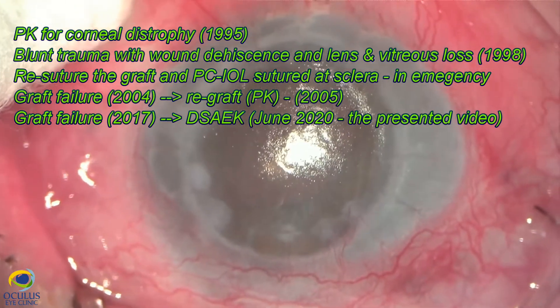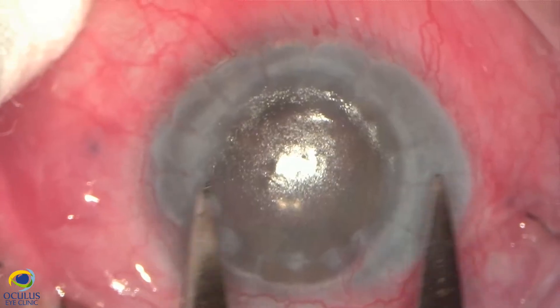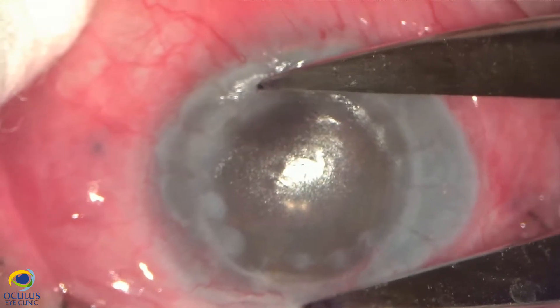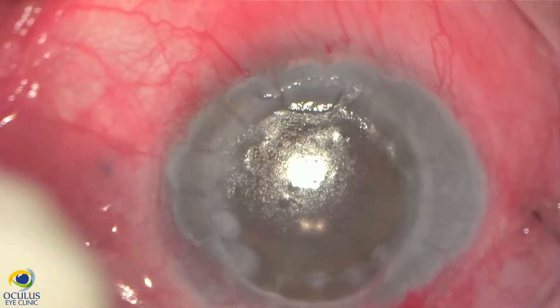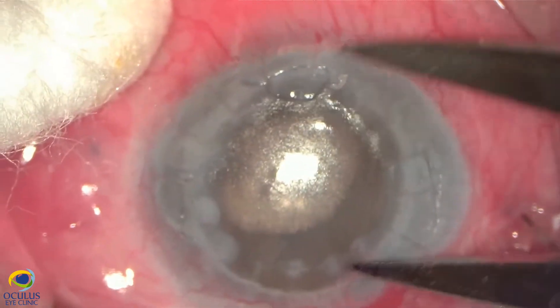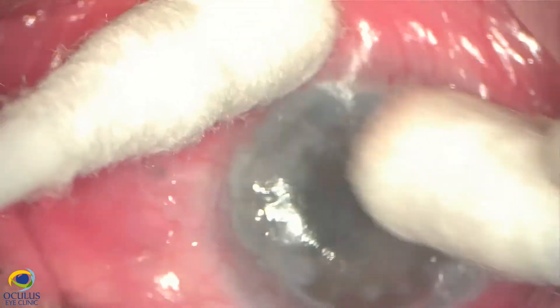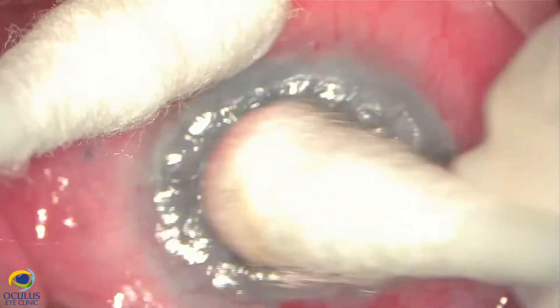We re-sutured the graft and sutured a PCIOL in emergency, but unfortunately the graft failed after 10 years. This is how it looks now and we decided to perform an ultra-thin DSAEK transplant in this case, after measuring the diameter of the previous PK, because we intended to perform a larger DSAEK transplant.